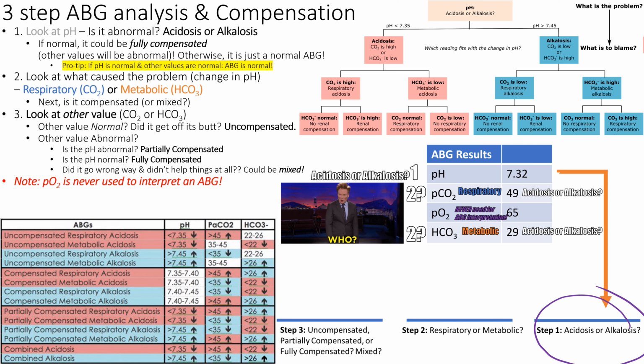What kind of acidosis? That's the next step. And the only two options are respiratory or metabolic, right? So you have to look at this like an algorithm, because if you try to memorize all the different steps, like that table there, you're going to have a really tough time. You have to think of it sequentially as an algorithm. Just like when you study AV blocks, if you learn it as an algorithm, you're good at it every single time. If you try to memorize which one's irregular, which one's this one, which one's that one, it's much more difficult.